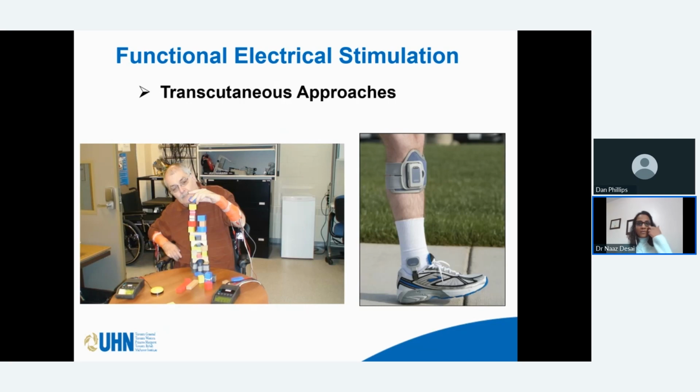Another classification of the FES, and I'm going to stick to only transcutaneous approaches for the purpose of this presentation. So within the transcutaneous approach, there is an approach where we are using FES to retrain a function. So the idea is that you do X number of sessions to train a particular task. Once those sessions are completed, the patient will be able to perform that task without the assistance from the FES. So that is one approach.